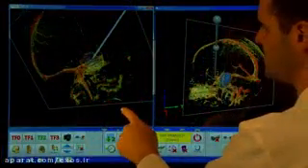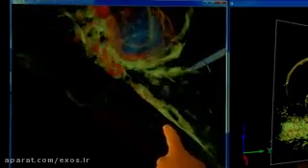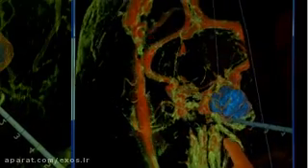With the ability to customize segmentation for individual cases, here we have a tumor case, and we've made the tumor transparent, and we're able to visualize where we are relative to, for example, the carotid arteries and the middle cerebral artery and the anterior cerebral arteries here. And here we have good visualization of the internal carotid artery with the middle cerebral artery coming over top.